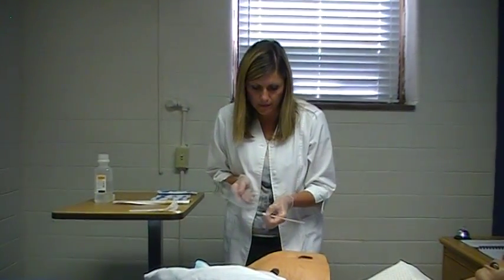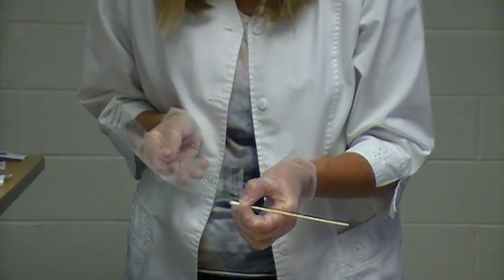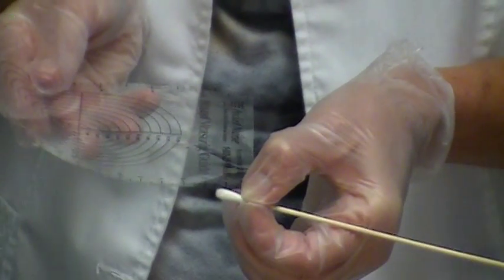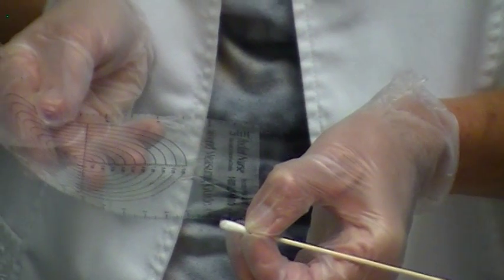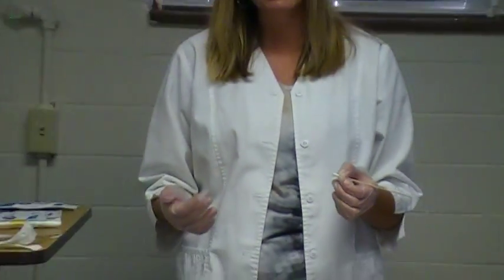And then what you'll do is you'll take your Q-tip and you will put it right against the 0 measurement on the tape measure. Where your fingers are at should be where the 0 for the measurement would be. And then you're going to see where that Q-tip, or the cotton tip applicator, ends. In this case, it's ending at 1.5 centimeters. So this wound is 1.5 centimeters deep. Once again, make sure you write that down if you think you will forget that.